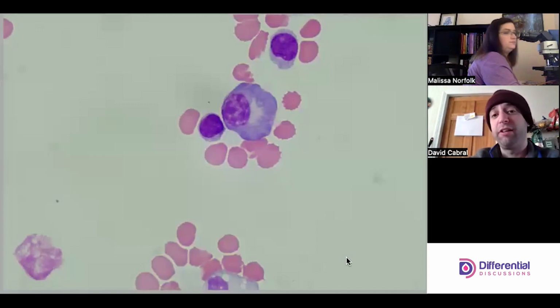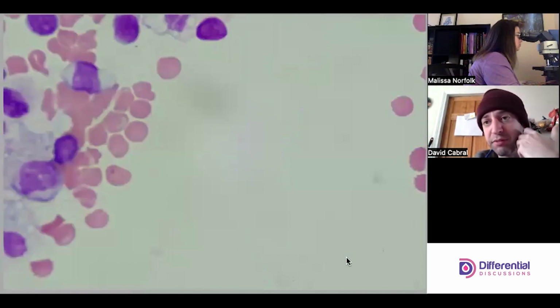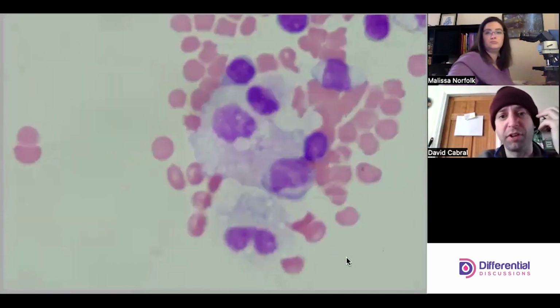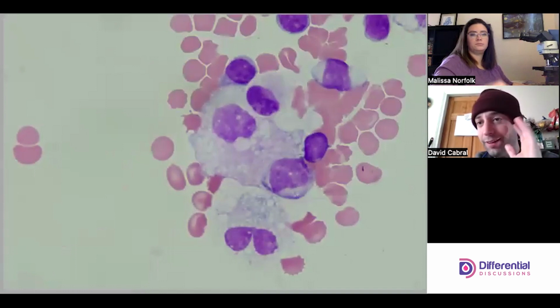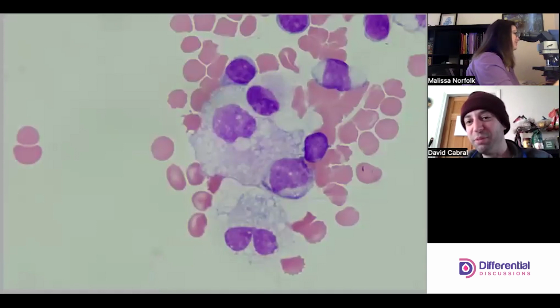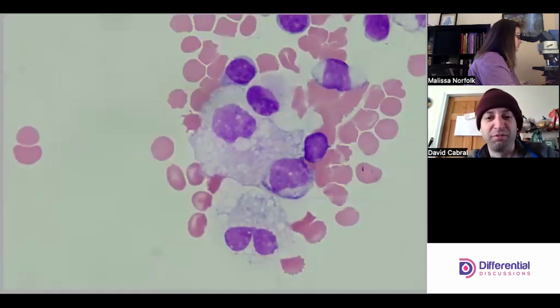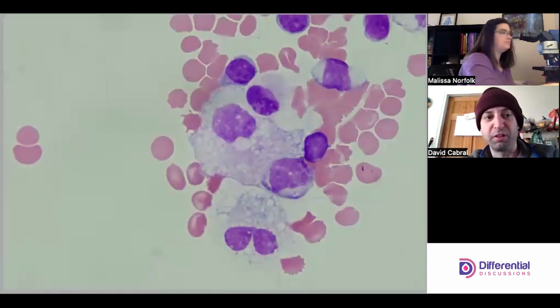And so we see a cell reacting, right? We can have plasma cells in types of infections, a viral infection, bacterial infection, and you can also see them in malignancies. And I think, hint, hint, wink, wink, those blobs we saw in the beginning looked a bit troubling for malignancy. Then we just got a couple of macrophages and some lymphs in here.